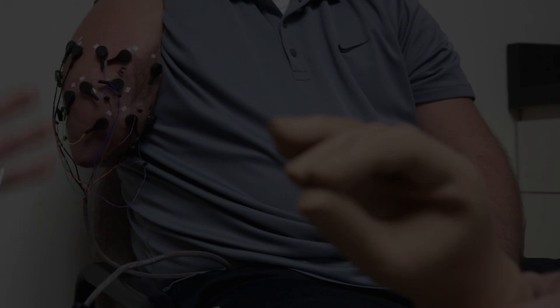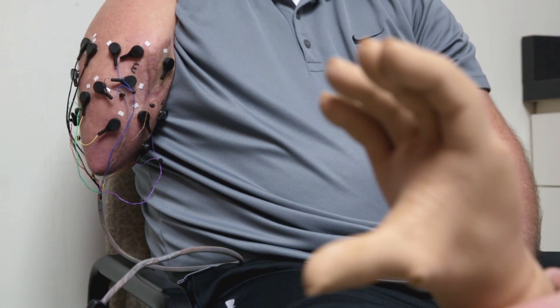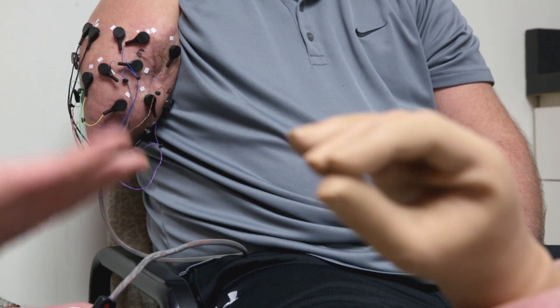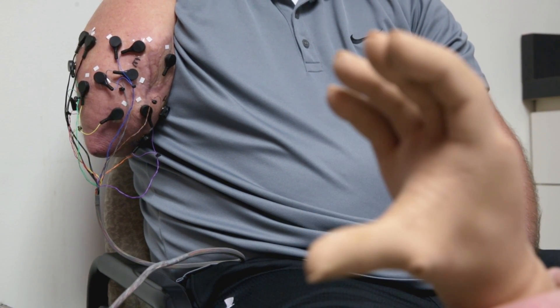The muscle, when you're making those muscle contractions, emits electrical activity — kind of like a radio emits music. Same thing: you can turn the radio up and it can be louder, turn it down and it's quieter.